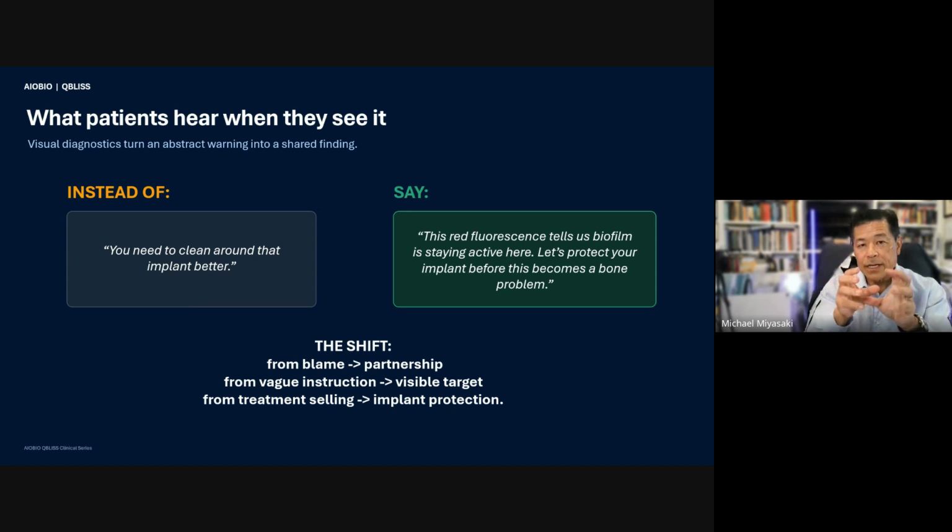We've got the threads, which we can show them on the radiograph. We've got a surface that's a little bit rougher on purpose to help the bone integrate. So instead of blaming the patient or us taking the blame, we start to build a partnership with the patient. We see that we have the potential to develop a problem. We're going to help treat you in our office, but what I need your help with is your home care at home. It's going to be very important for us.